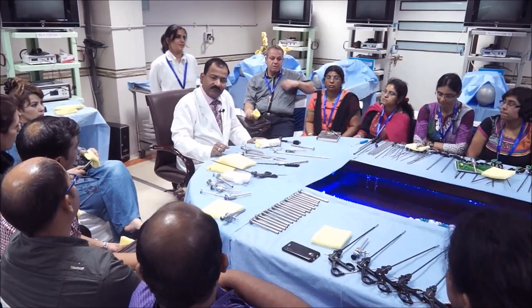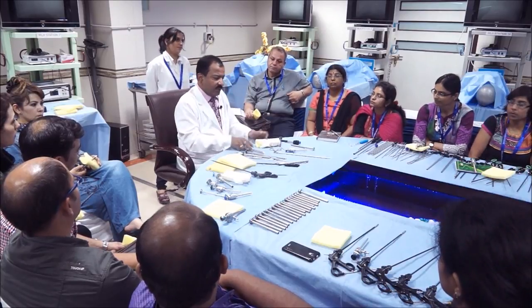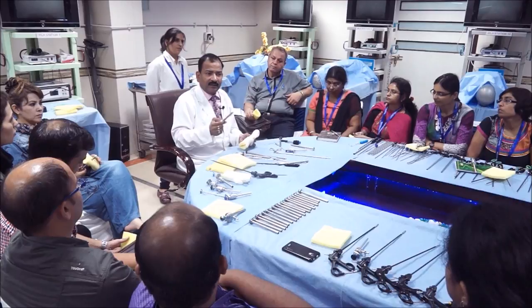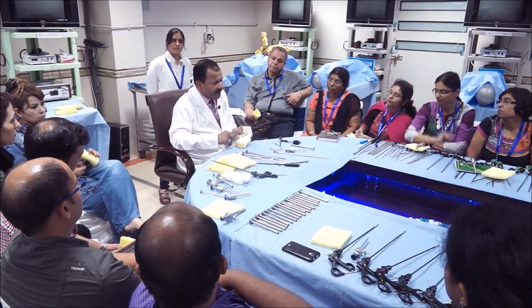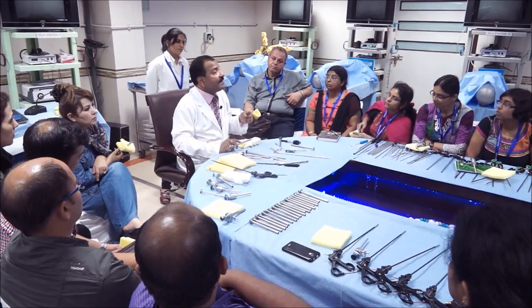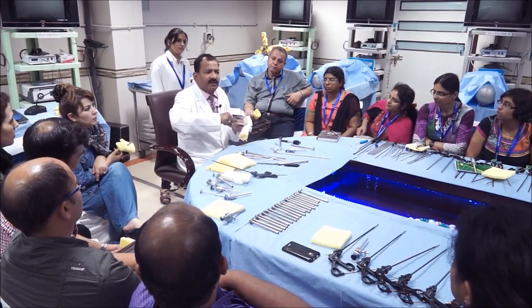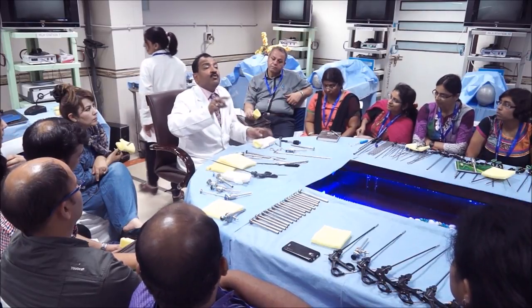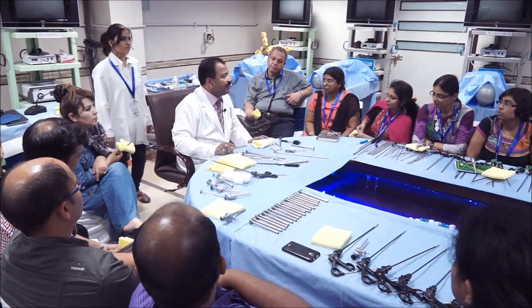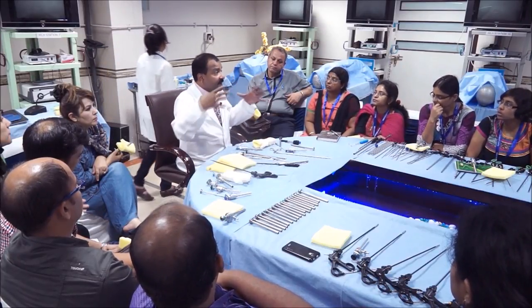Yes, always. For the primary one also, it must go perpendicular. And this is guarded, under control. Suppose you can lift the abdominal wall a little bit, although lifting a distended abdominal wall is not easy. But if you can lift it a little, then you can give a little angle. But you will not be able to point it towards the anus. And if you do that, you will go preperitoneal, because it is now already distended.